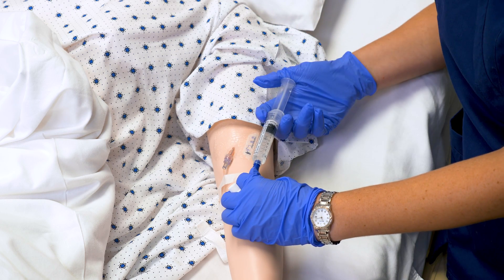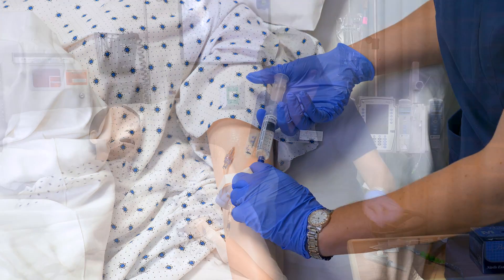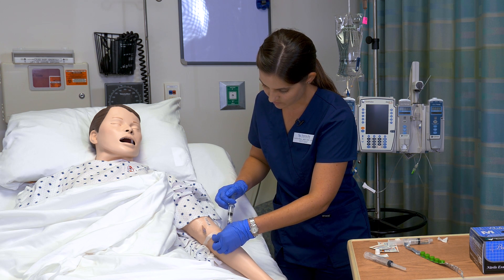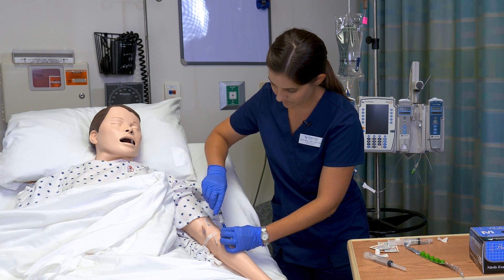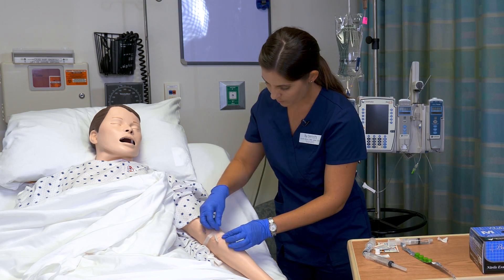I'm using a slow push with the peripheral IV in order to avoid damaging the smaller vessels. As I'm flushing in the remaining one mL, I need to clamp my line to provide positive pressure because this is a negative displacement valve. I will then replace with a new kerose cap.